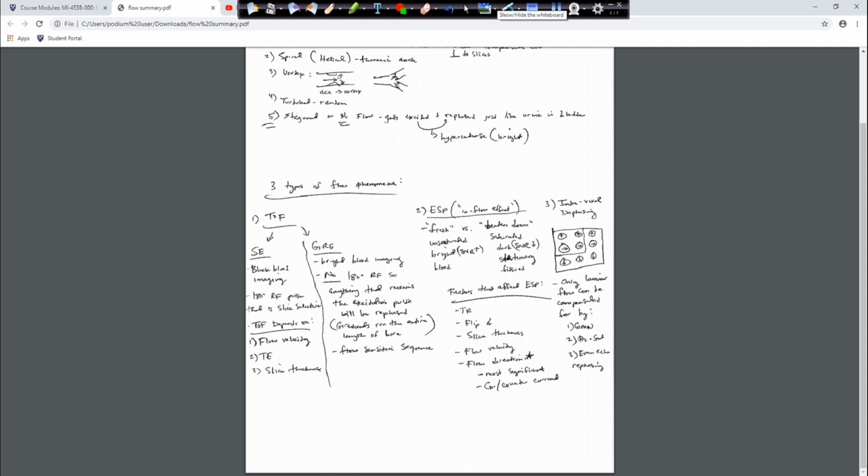Remember, water and fat are in phase with each other at certain times, and out of phase with each other at other times. So with that gradient echo, usually it's 2.1, then 4.2, 6.3, things like that. Okay. So that's just a quick recap of what we talked about in Chapter 6, so that you have an idea of what we're going to discuss today.